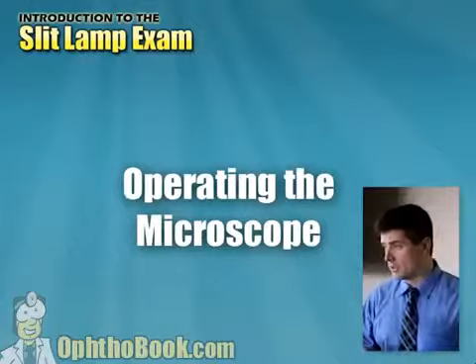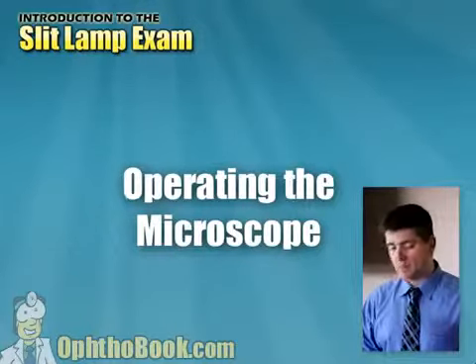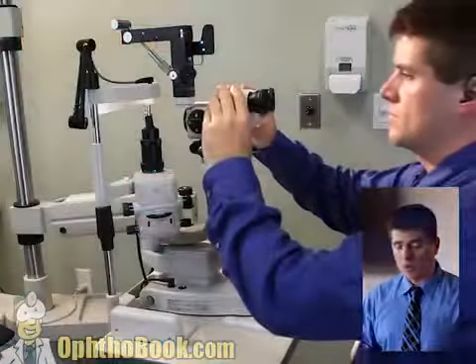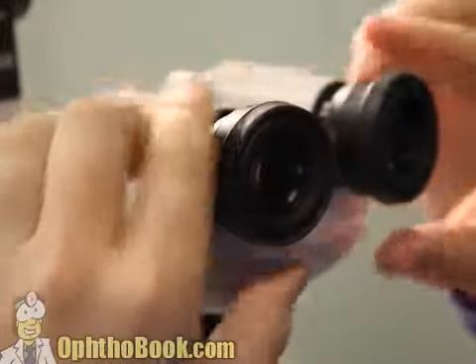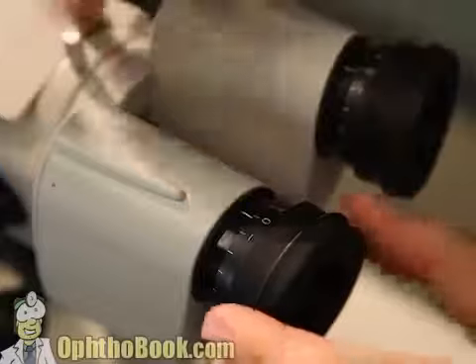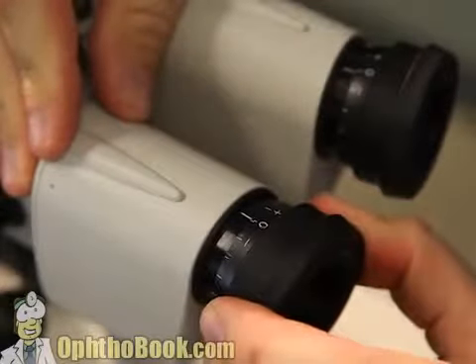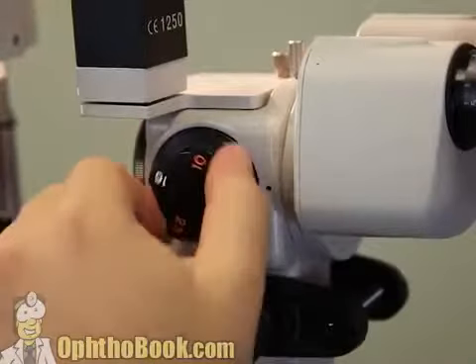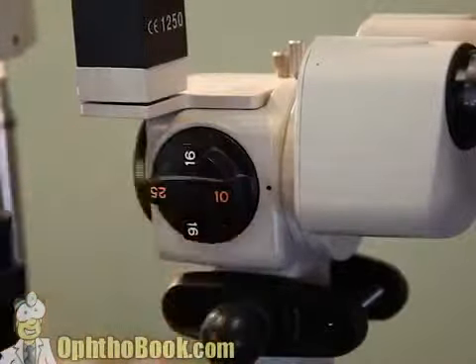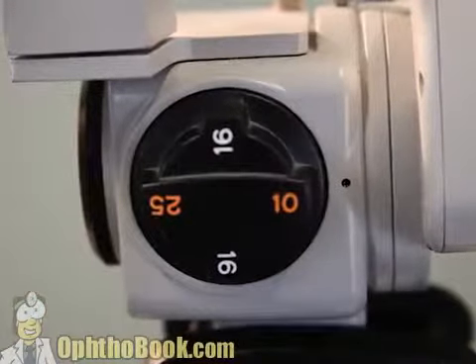Let's learn how to operate the microscope, and we'll start from the beginning. Of course, the first step is to get your eyepieces at the correct pupillary distance, and that's very easy. And then, of course, you set your dioptric power to your own eye. And for most of us here, it's probably set to 0. Use the magnification barrel. I like to work in the lowest magnification for the entire exam. I don't really need higher mag.